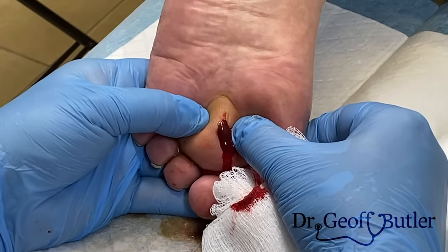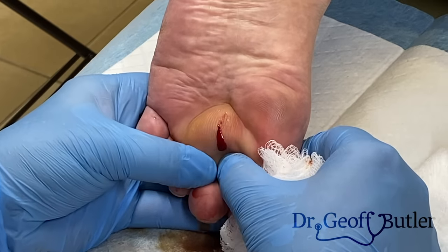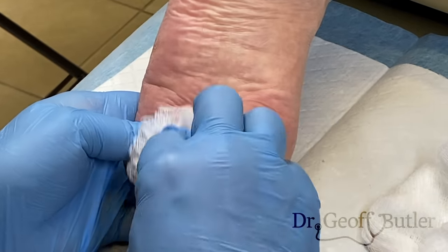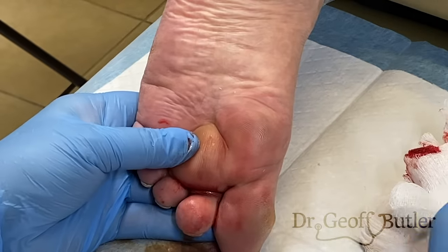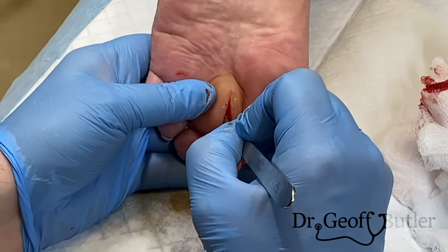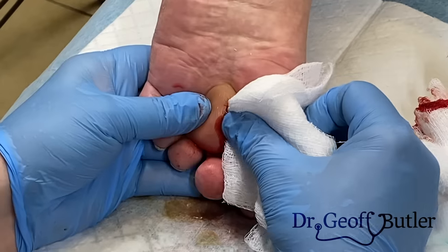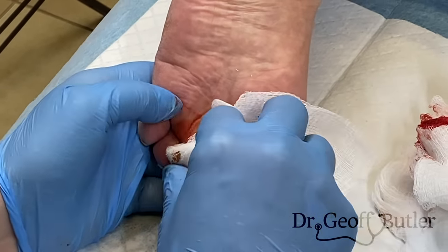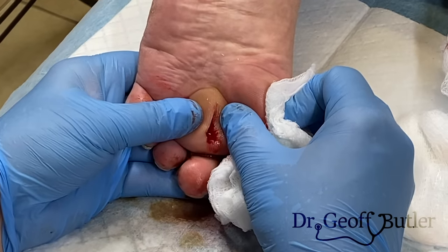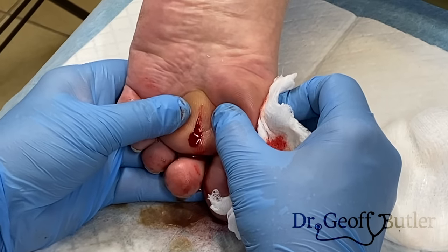The freezing we put in was really uncomfortable for him. This will feel better once we're done. Let's see if I can extend this a little bit — does that hurt what I'm doing right now? No. So you can see how opening that up and cutting through it didn't hurt him, but when I put pressure on it, it hurts.